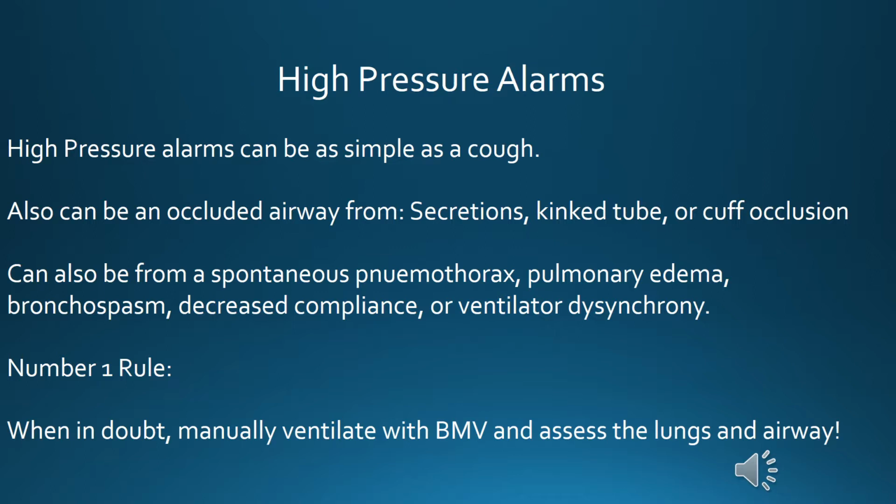But the number one rule to remember is when in doubt, always disconnect from the machine, manually ventilate with a bag valve mask, and assess the lungs and the airway, listening for wheezing from bronchospasm, decreased breath sounds of a pneumothorax, crackles of pulmonary edema, etc. So diagnosing why you're getting the high pressure alarm is of utmost importance.